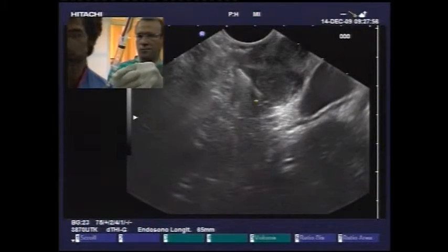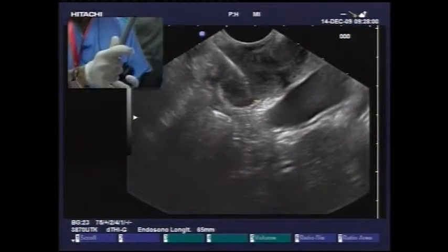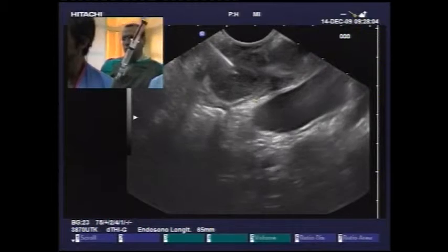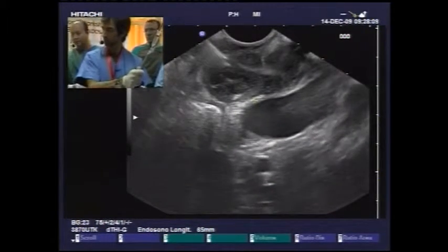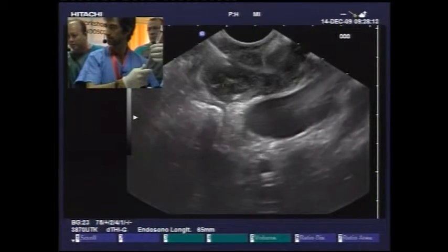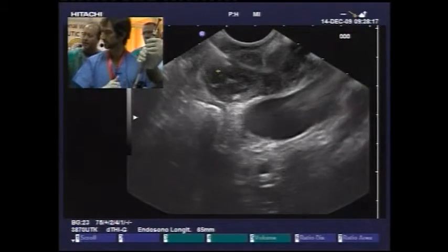Okay, now we can open, and now I can go back gently to have the core inside the needle. So we are. I close. That's very nice. And so you apply the vacuum. Once you're deep in the needle, you withdraw, but remain inside.